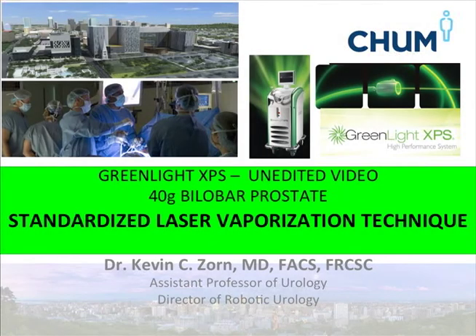GREENLIGHT XPS, unedited video, 40g bilobar prostate, surgery and narration by Dr. Kevin Zorn. The following educational video will take the viewer through the standard vapor technique for GREENLIGHT XPS. This represents the ideal cases to be done in the initial learning curve of one's experience with the prostate under 50 grams.